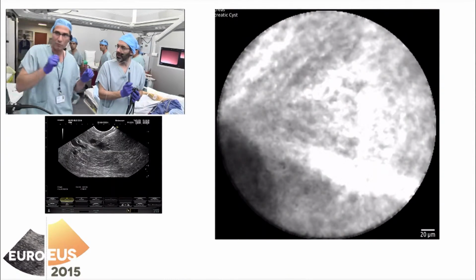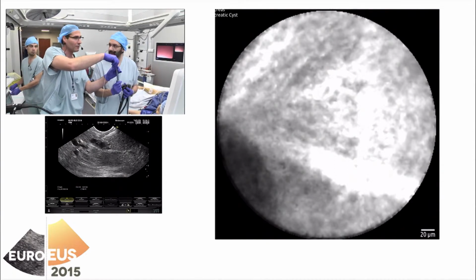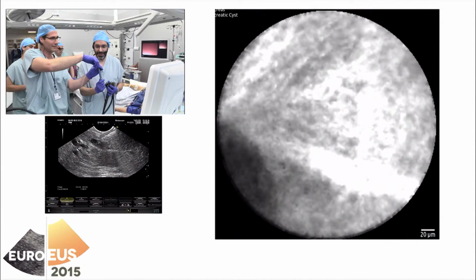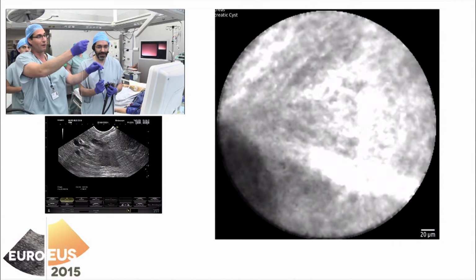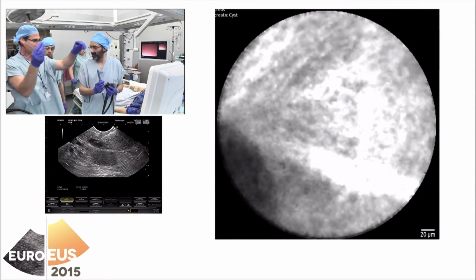So we will remove the needle. Do you want to aspirate? I'm going to ask for a show of hands, okay? I'm not going to do that. Five minutes, less. We will finish, just obtain some liquid from the lesion also.